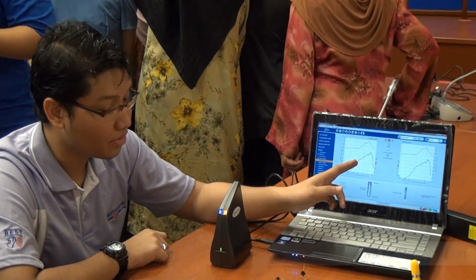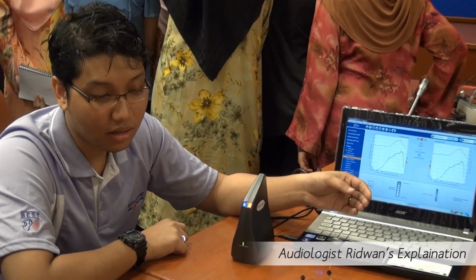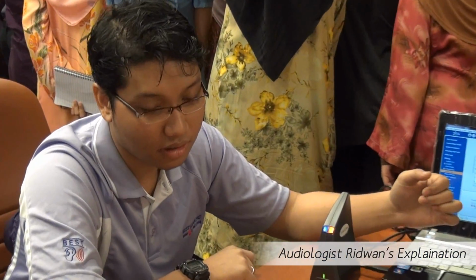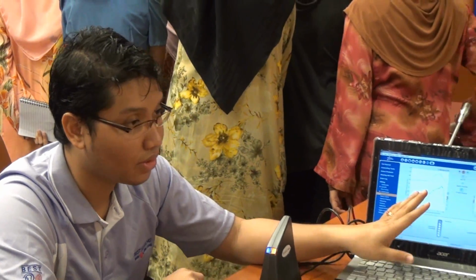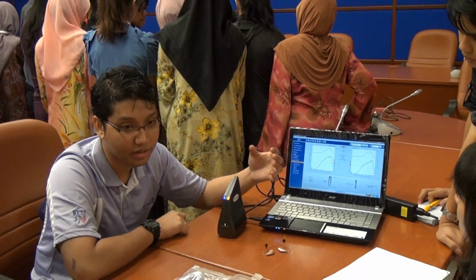For the spec track, we set for the patient with the high frequency hearing loss. It's about 4 kHz and above. It's about profound, so it's better for us to set the spectral IQ to on to make them hear the speech more clearly.